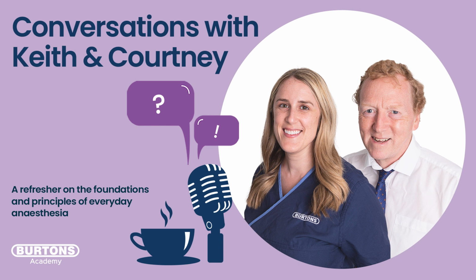It still delivers the gas, it still delivers the volume. You could argue in some senses that it delivers it nice and smooth and evenly, gives a chance for the lung to expand and all those alveoli and airways to open up fully. But that's another story. And I think you can probably do that with 1 second, 1.2 seconds, rather than needing to go to 3 or 4. That's kind of like going... and it's a really long inspiration. Yeah. So exactly. Intuitively, it just feels wrong, doesn't it? That's way too long. So let's just say 1 second.